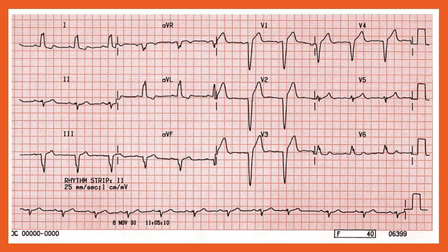Here's another EKG. Take a moment and look this one over. Okay, we can all appreciate the fact that when you look at V1, here's the bend of the QRS complex into the ST segment. You can see here that this most definitely is a widened QRS. And so that's going to cause us to look for a bundle branch block, right? And differentiate the bundle branch block.